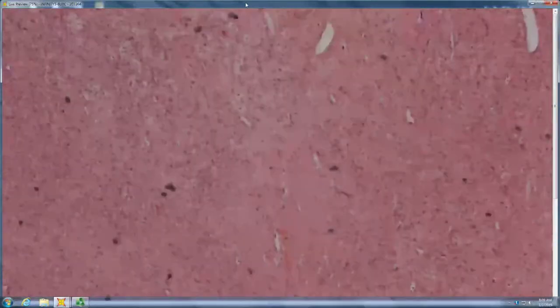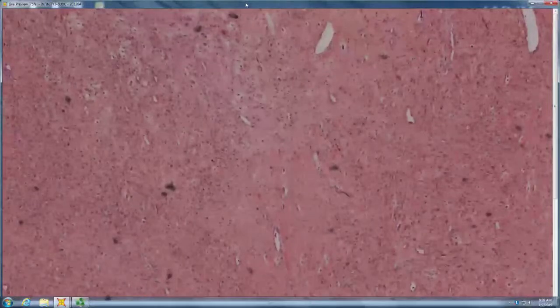Triton tumor? This is a salamander. No, it's not. This is a malignant Triton tumor from a patient, but it looks like a regenerating salamander tail.